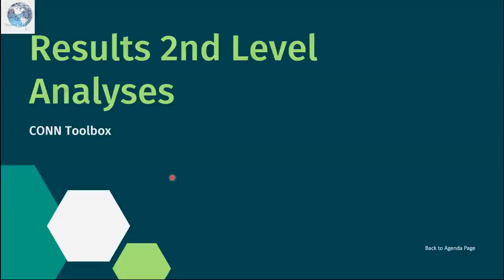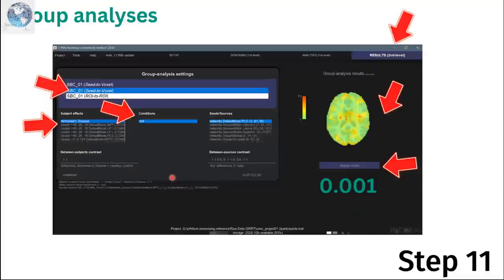And then you go for second level analysis. Second level analysis is a group analysis, meaning that you group, like us, we have healthy control and Alzheimer's disease. I previously had 22 subjects. 11 subjects were healthy controls, 11 subjects were Alzheimer's disease patients. So here I designed to compare between these two groups. So we group the subjects.